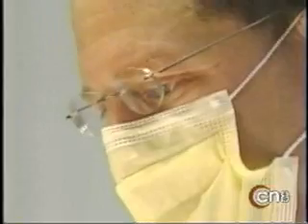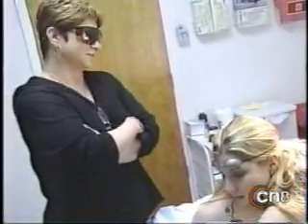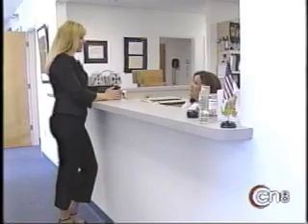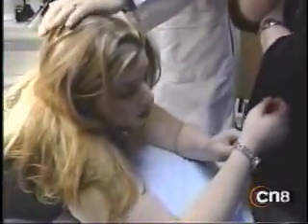The numbing part makes it fairly painless, but it does pinch the pocketbook. For a $73 tattoo, I've now spent $600 and it's not done yet. Tattoo removal doesn't come cheap. In fact, multiple treatments can total a bill into the thousands of dollars depending on the size of the tattoo. The process is also time-consuming. It's very hard to tell until we get going, but anywhere from 6 to 10, and that's for a multicolored tattoo. Amateur tattoos you can get rid of in 1 to 2, 3 treatments. But don't worry, we'll do it.